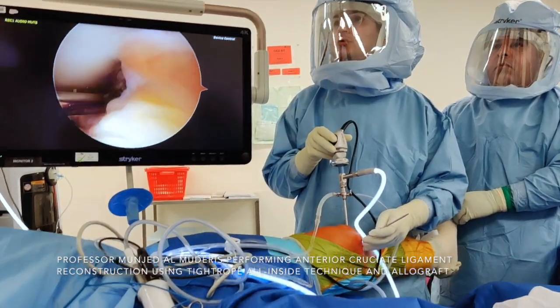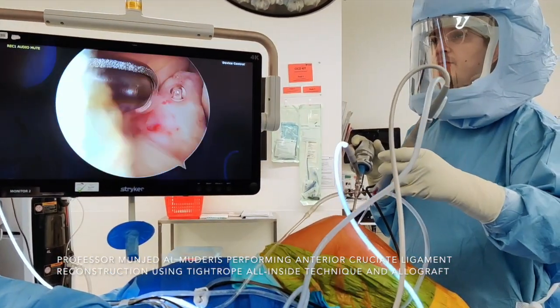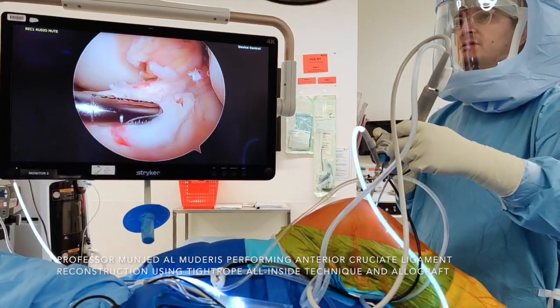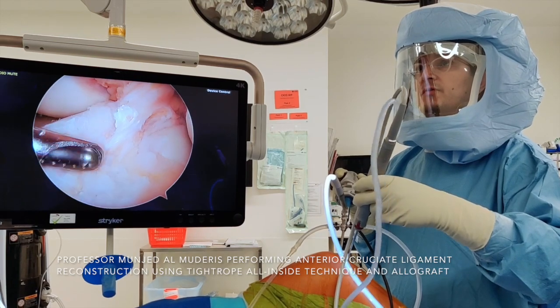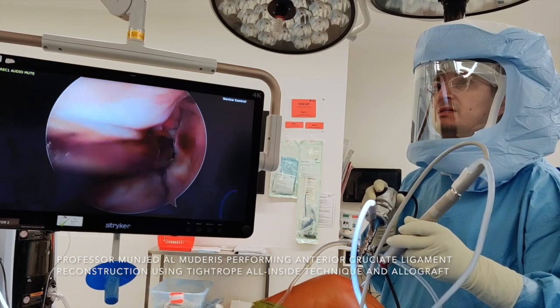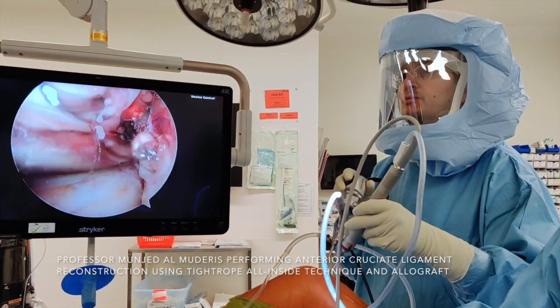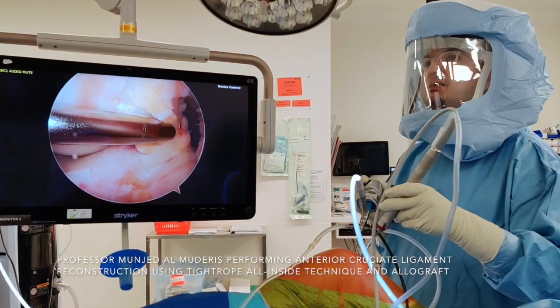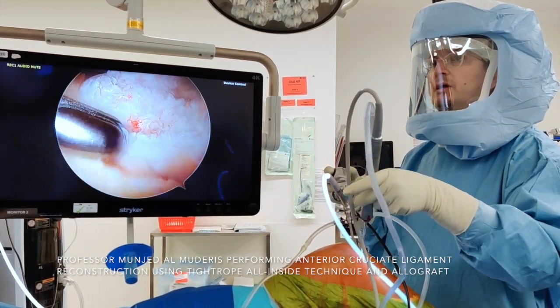Positioning the leg in the working position. I use the shaver to clear some of the stump. There is a beginning of a cyclops lesion forming and we need to remove that to prevent anterior impingement. After clearing the anterior part of the tibial component of the stump, I move to the femoral component and clear the remnant of the ACL from the femur. Care must be taken not to perforate the posterior capsule, as the neurovascular structures lie behind the capsule. This is the PCL ligament — beware of the inter-meniscal ligament anteriorly, not to violate that structure.